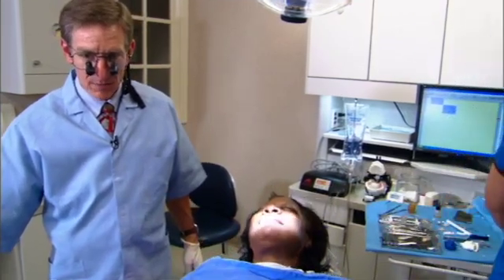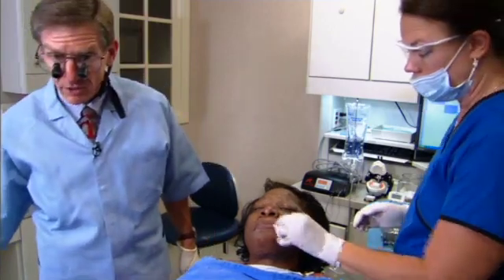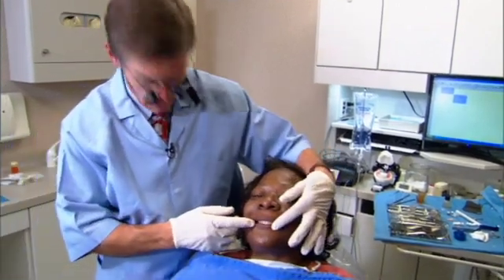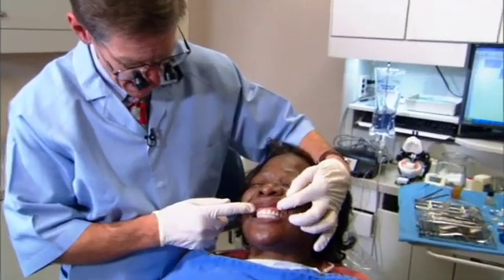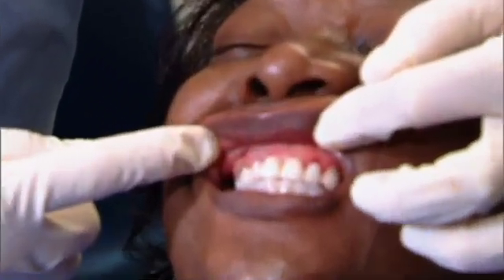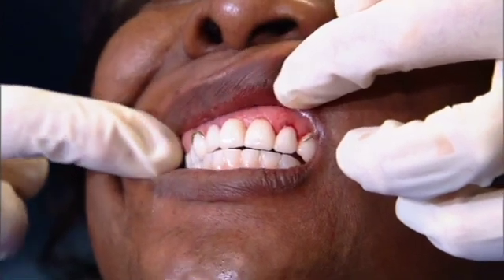I'm going to try and keep it so that you can now get a little bit of a better view of how Beverly's going to look. Can you even smile? Nah, your lips are completely dead. Okay. There she is. She's got just 2 little clasps that are going to show. And in the end, we won't have any clasps at all because we're going to be implant retained. The other thing you'll notice is the partial just kind of disappears into her mouth.